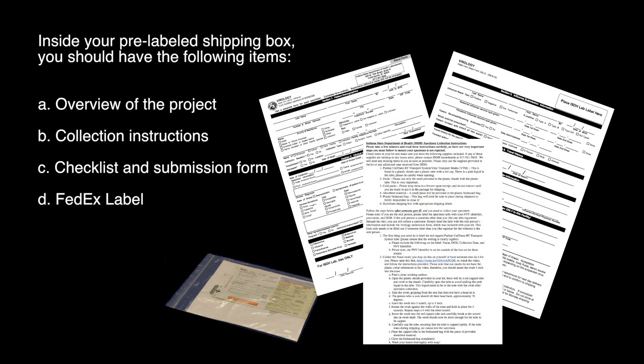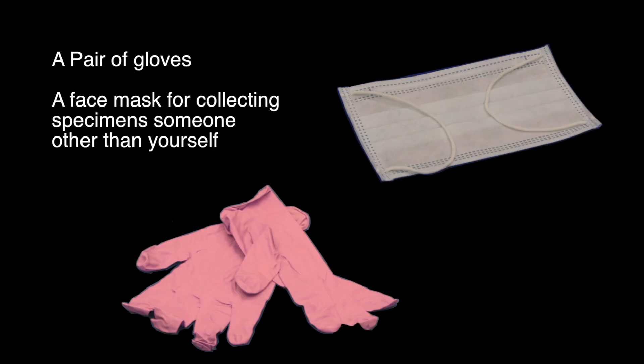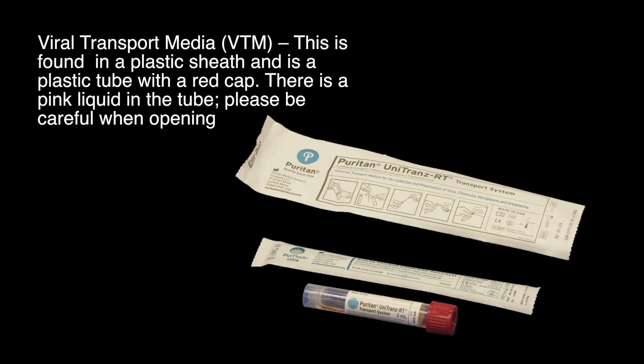Inside your pre-labeled shipping box you should have the following items: your paperwork including an overview of the project, collection instructions, a checklist and submission form, and a FedEx label; a pair of gloves; a mask for collecting specimens from someone other than yourself; viral transport medium, found in a plastic sheath — a plastic tube with a red cap containing a pink liquid inside.